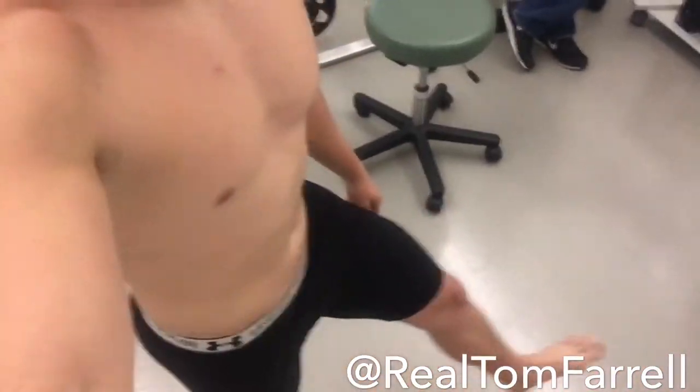Going in the bod pod. Let's go. I am in just spandex right now. I'm about to hop in the bod pod to find out my body composition.